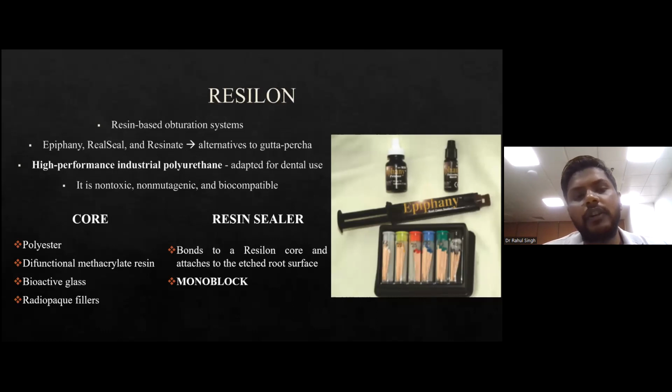It is non-toxic, non-mutagenic, and also very biocompatible. But now the use of Resilon as Epiphany sealer is obsolete because of the cumbersome process. You have to apply it in various layers. A primer layer is applied because it's a self-adhesive system. So a primer layer, then a sealer, and then the core is applied. So it's a cumbersome process.